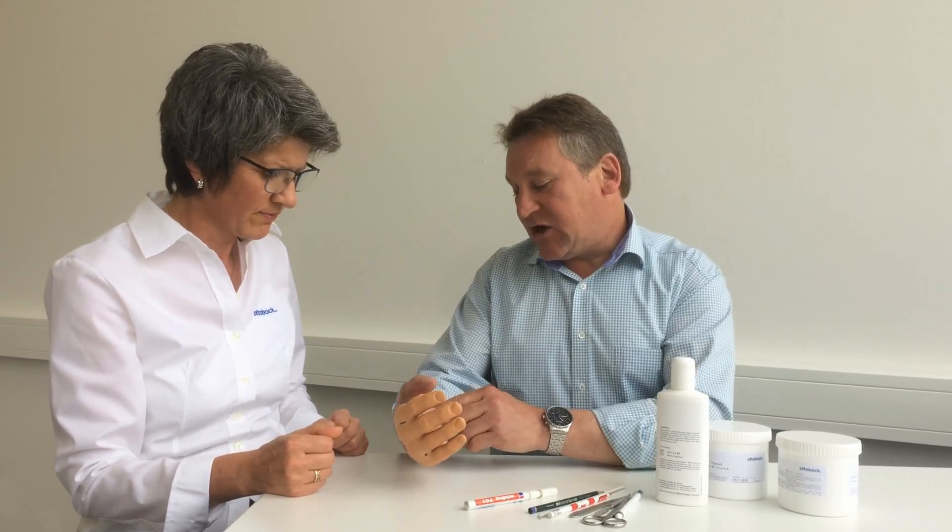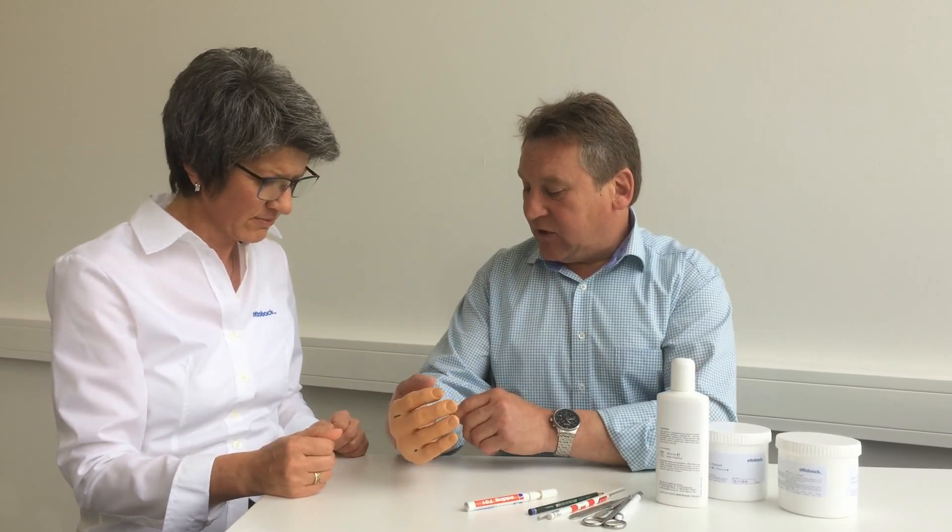How does that feel? I can't move my thumb very well. Could we please adjust something? And the brim of the prosthesis is cutting into my forearm a bit too.